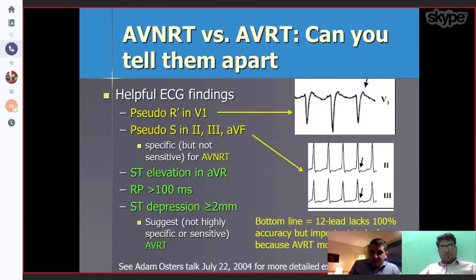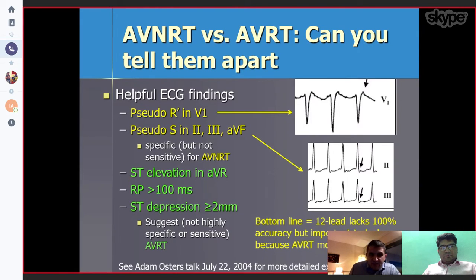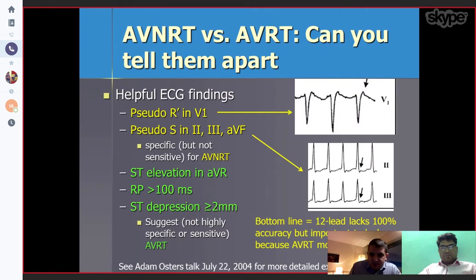It is easy to distinguish AVNRT from AVRT in the EP lab, but on ECG it can be difficult. There are some clues: a pseudo-R in V1 suggests AVNRT; pseudo-S in leads II, III, or AVF can also indicate AVNRT. If you see ST elevation in AVR, RP interval more than 100 milliseconds, or ST depression more than 2 millimeters, that could suggest AVRT. The bottom line is that the ECG is not 100% accurate, but it can be helpful in diagnosis and guiding treatment.